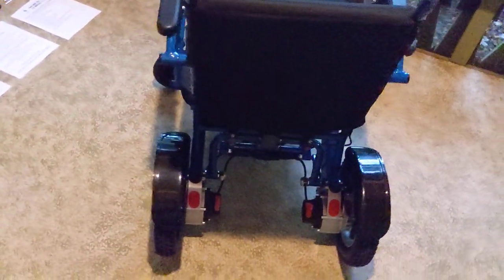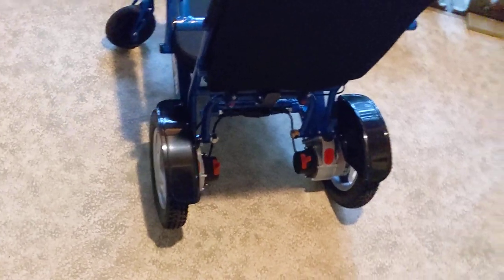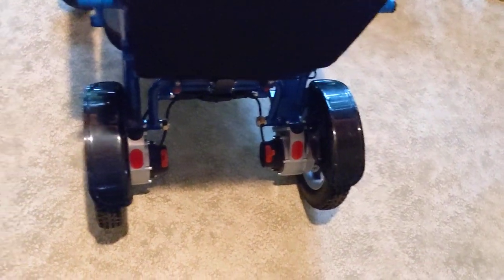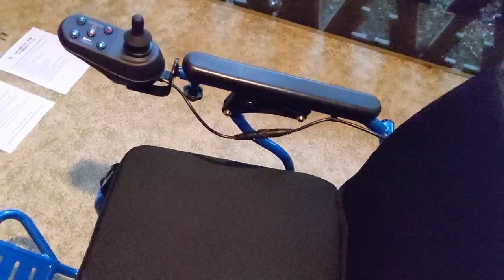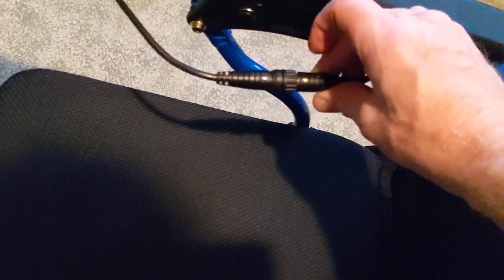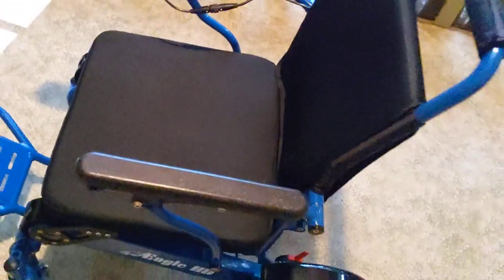A few things people ask me about are the anti-tip wheels — or lack thereof — which are just a gimmick. We'll get into that in a bit. The joystick can be mounted to the right side or the left side; from the factory it's on the right side, and it has a very easy little buckle to detach the joystick itself. The seat cushion itself — we have 18 and a half inches of space in between the armrests of the Eagle. The cushion is an 18-inch memory foam cushion.